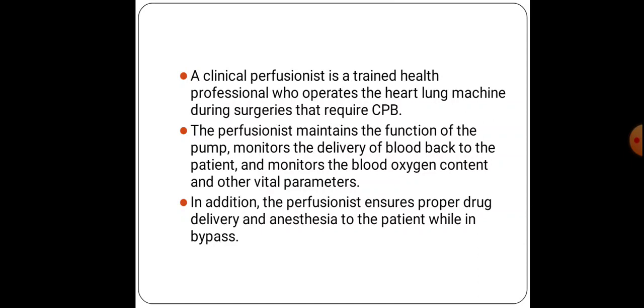With the help of the perfusionist we can monitor all the parameters of the blood. The perfusionist maintains the function of the pump, whose main function is to provide flow, and monitors the delivery of blood back to the patient. We take a certain amount of blood from the patient, and the same amount is delivered back to the patient.